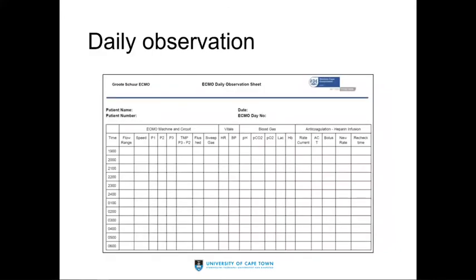So if we ask you questions on the ward round, and the nurses are recording certain variables like the transmembrane pressure, or the delta P, which is the pressure across the membrane, because if that starts to go up, then it can potentially be a sign of the oxygenator clotting. They also run a heparin infusion from a 50 ml syringe and target an ACT target, normally between 160 and 180, as per the earlier trial.